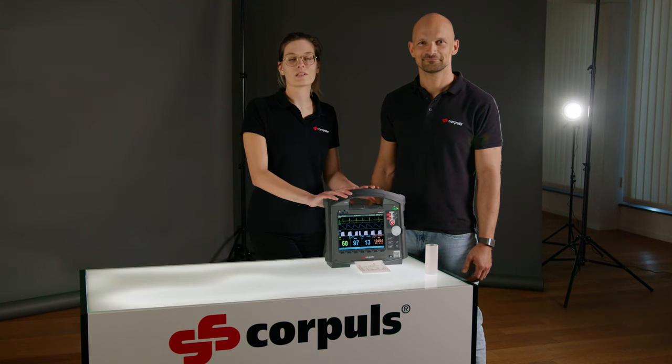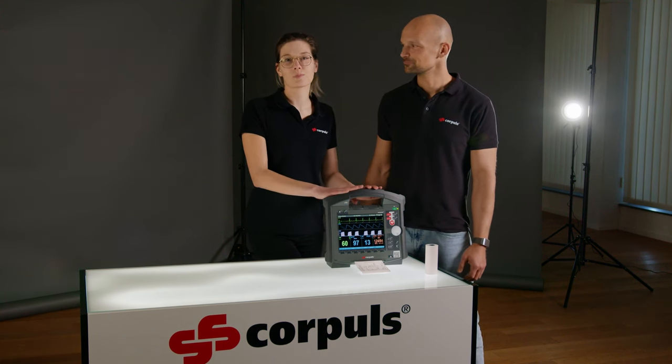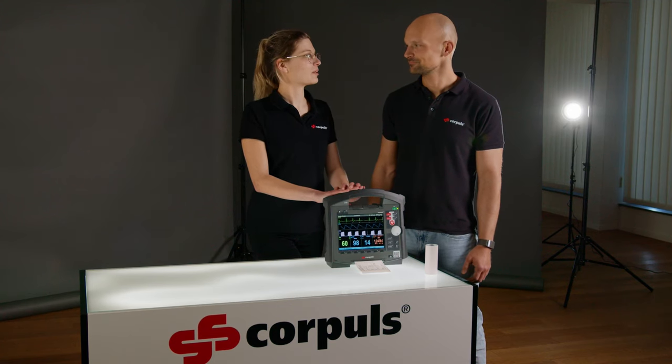Hi and welcome to a short video that covers how to correctly replace the printer paper roll. Andy, would you like to demonstrate this? Yes.